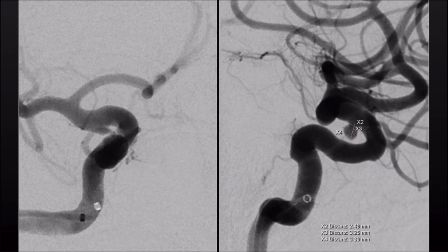Our plan is to coil the saccular proximal aneurysm and then to implant a flow diverter all along the way from the dysplastic aneurysm to the proximal saccular aneurysm, so that we cover both aneurysms with the flow diverter. Here distally you can see the fusiform dysplastic aneurysm.